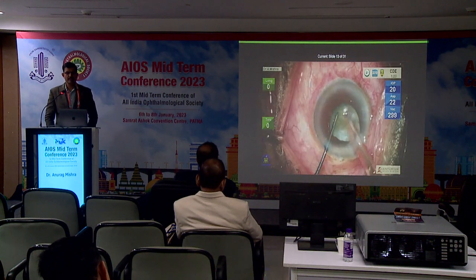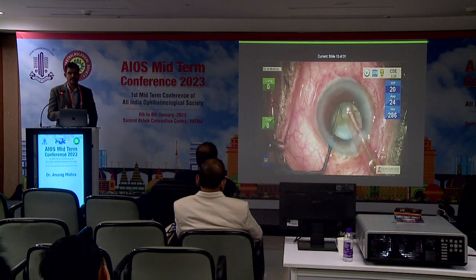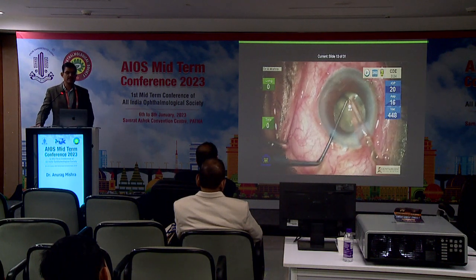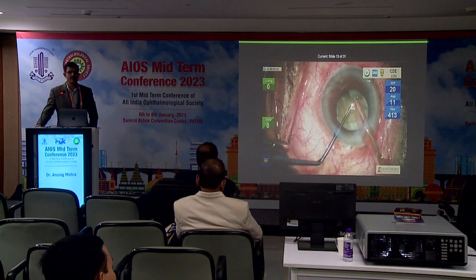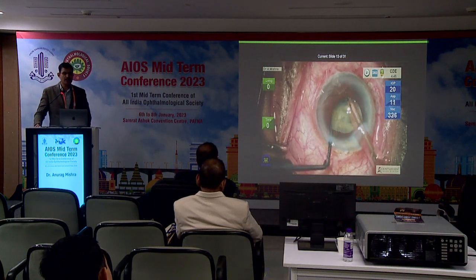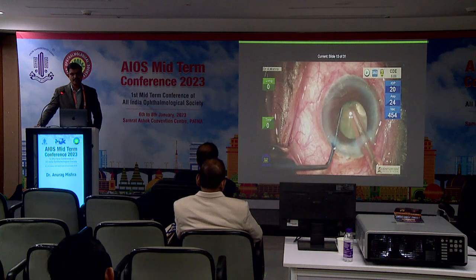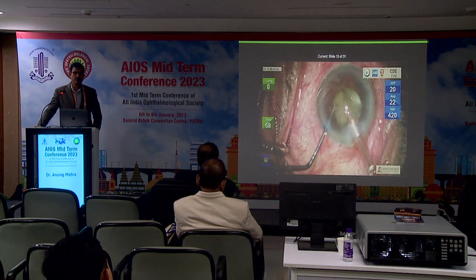But once that is done, the nucleus management again becomes easy. The IOP stays at 20, and mind you, such cases the anterior chamber is shallow more often than not, but still the IOP of 20 does a reasonably good job. This is done without Active Sentry, and you can look at the stability of the anterior chamber despite the vacuum sitting at 450, and in panel mode it doesn't show a dip towards the end. The IOP is 20, reasonably hard cataract, shallow AC, but still it does a reasonably good job. In fact, a very good job in keeping the anterior chamber bloated all the time.